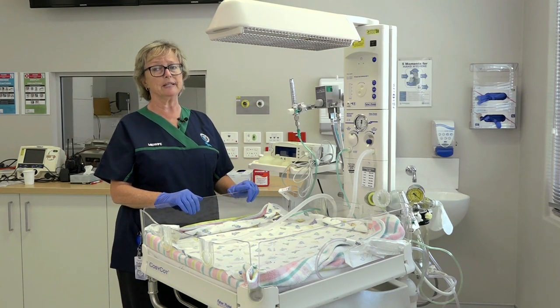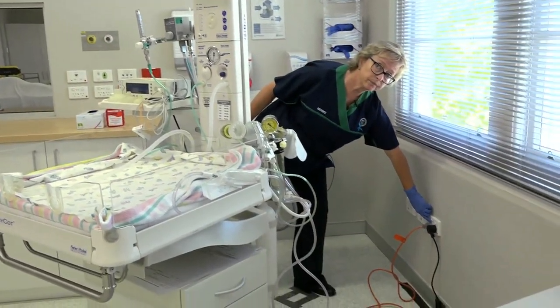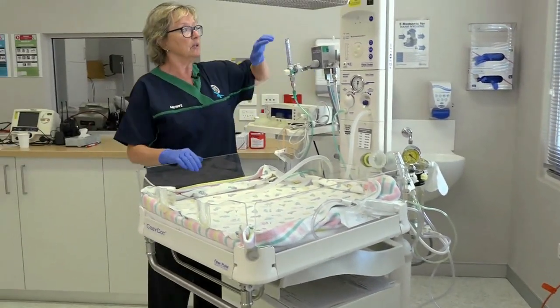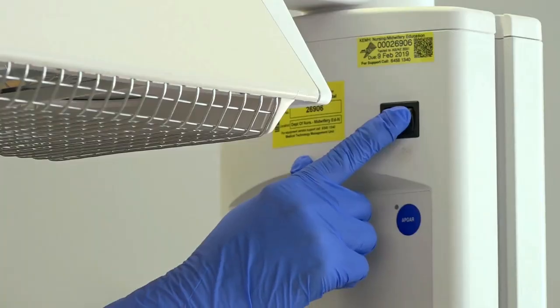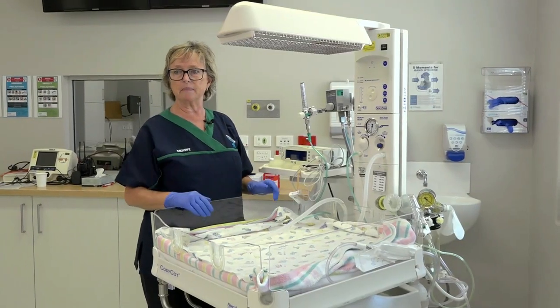The first thing we're going to do is turn it on. We need to turn it on at the wall, and then we need to turn it on on the cot. We know that it's come on because it's made a bit of a buzz.